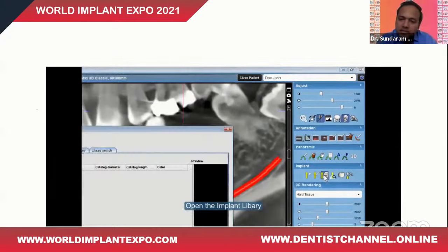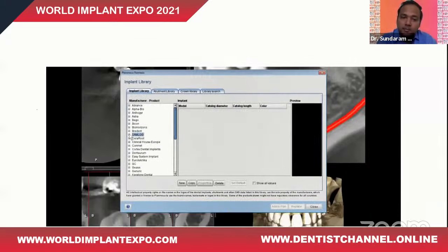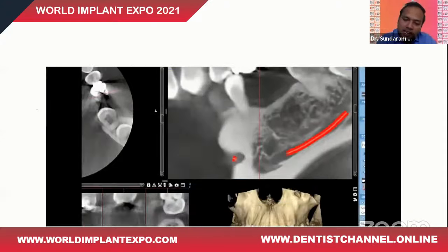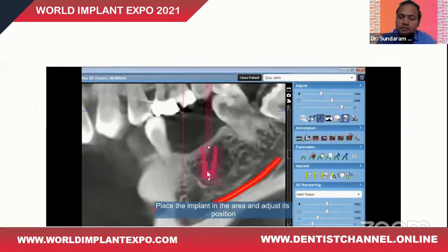So once the nerve has been traced, I open up the implant library and then select the choice of implants that has been listed, and the dimension of the implants has been selected, and then I add that plan to the images, and then I get something like this.